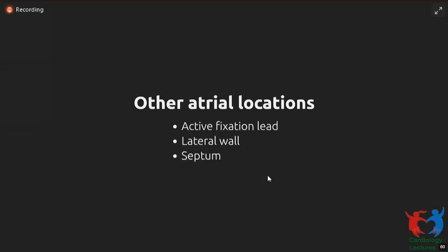For passive leads, again, you pull back the lead and make sure that the tip has reached the apex of the appendage. For active leads, again, it's very important, because your lead may be just floating inside the appendage, and if you fix like that, it's not going to get fixed. So pull back on the lead, make sure that the lead tip is contacting muscle before starting to fix the lead.